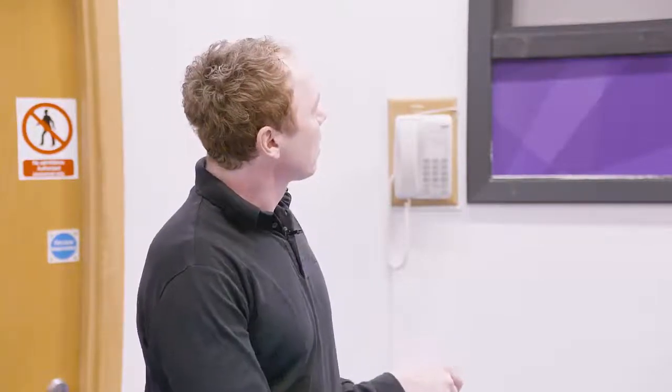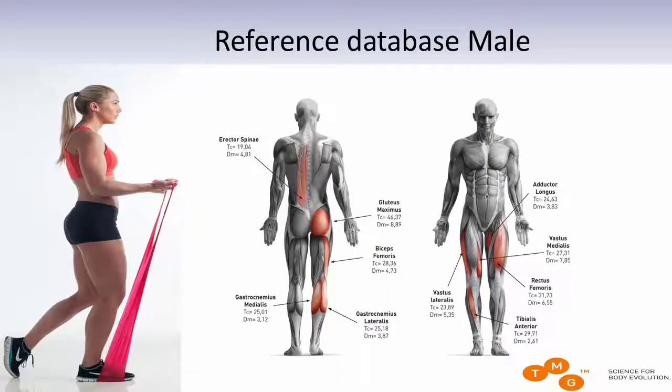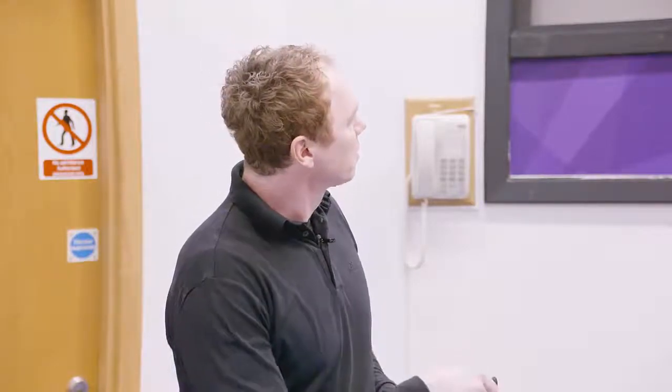These 10 muscles which are highlighted here are the most frequently measured muscles. So if you have a subject who is involved in a sport which predominantly uses lower extremities, these 10 muscles will be measured. Sometimes adductors are not measured, so if you have a sport in which there is not a lot of lateral movement, these adductors are maybe not as important, but at least the other 9 muscles, if you run, you will use those muscles, and it is very important to see what their properties are.